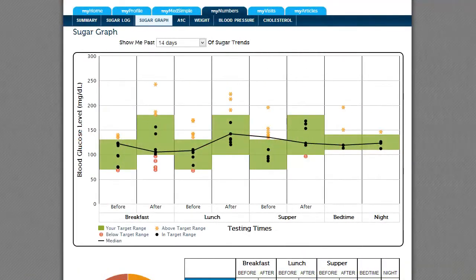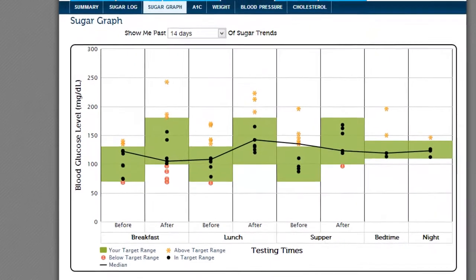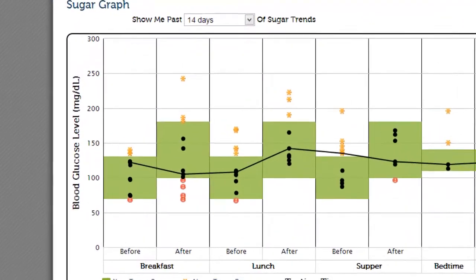Welcome to your personalized sugar graph. This is where you can see your sugar entries laid out in graph form. The graph makes it easy to see where you are doing well and where your blood sugar control could use some work.